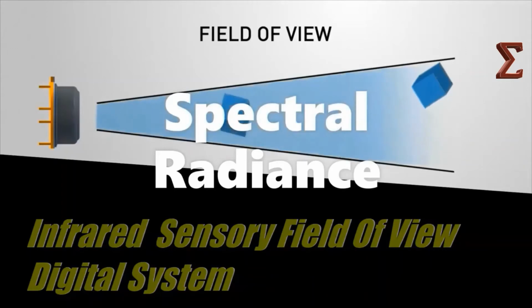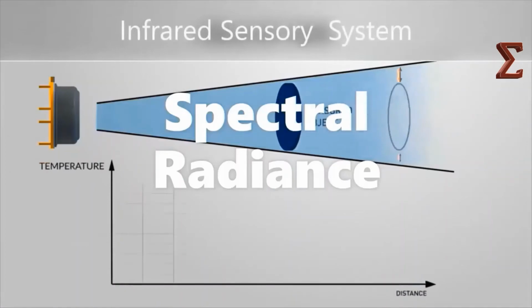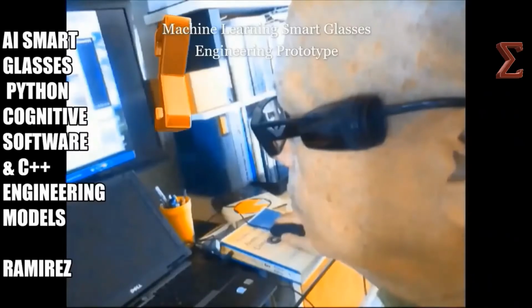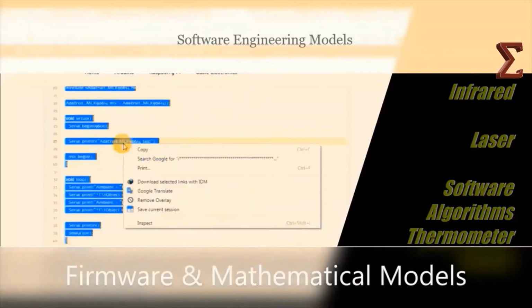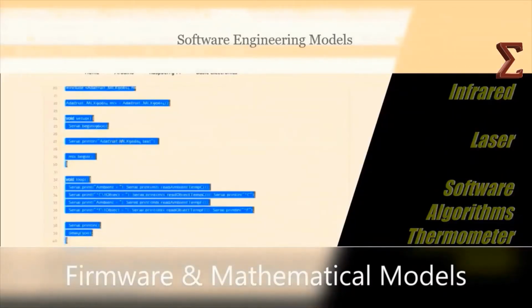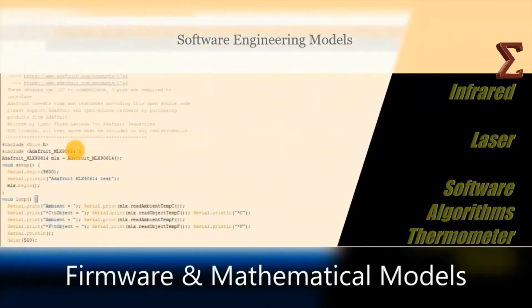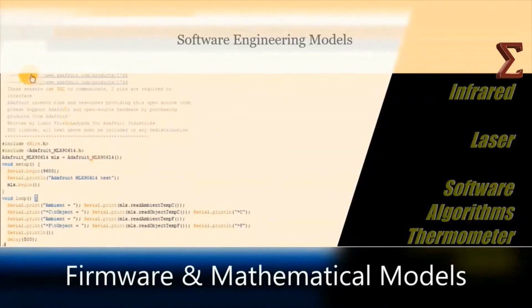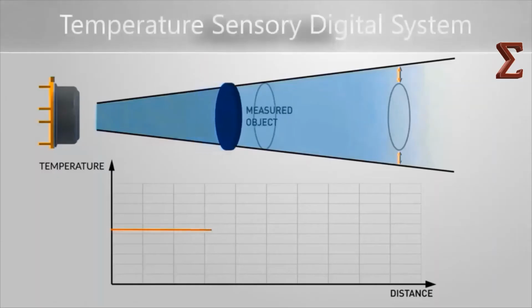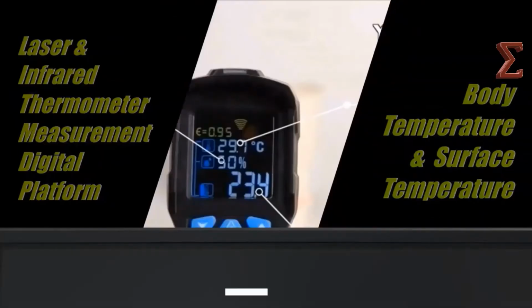Emissivity parameters. All objects reflect, transmit, and emit energy. The emitted energy can indicate the object's temperature. So, when the infrared thermometer system measures the surface temperature, the instrument can receive all three kinds of energy, caused by infrared energy reflected from other light sources.